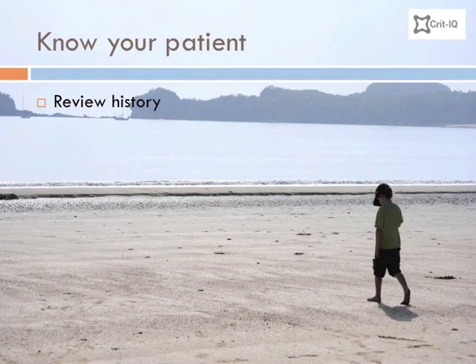A number of factors will affect decisions you make for your transfer. For example, what carbon dioxide will the patient tolerate? Patients with injured brains should always have their CO2 controlled, while in other patients a higher level can be tolerated. Does the patient have any drug allergies? Is there an advanced healthcare directive? Does the patient have a spinal injury? Does the patient have an infection control issue, such as MRSA colonisation?